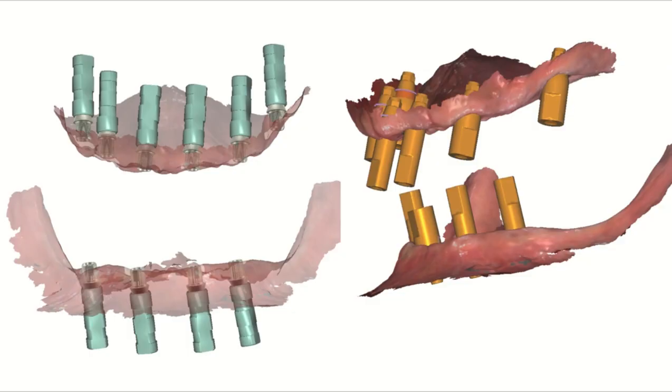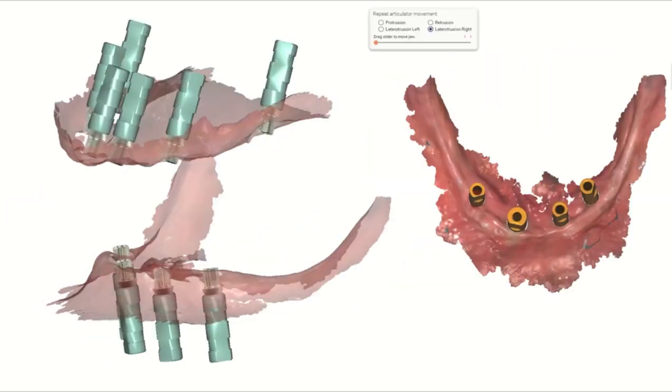Note the parallelism of these prosthetically driven implants. This will positively, of course, influence the passivity and of course this will affect the longevity of your final restoration. So we get what we planned for. Look at the final result. Implants in parallel, implants within the bone, implants respecting your final prosthesis.